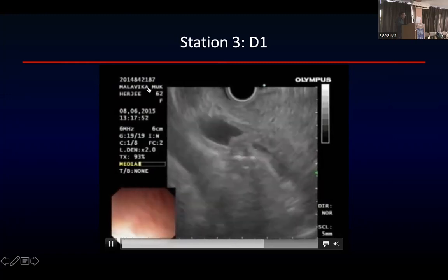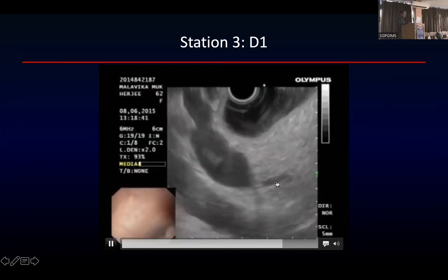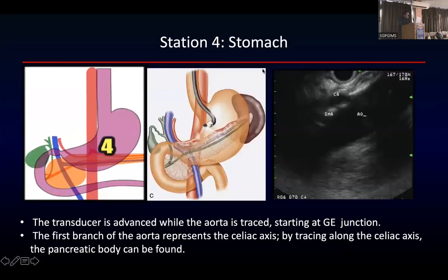This patient is still on follow-up, 2014. So we were confused कि इनको malignancy है कि नहीं. Okay. So this FNA was done from this, which was negative. Okay. So this again station stomach station 4.